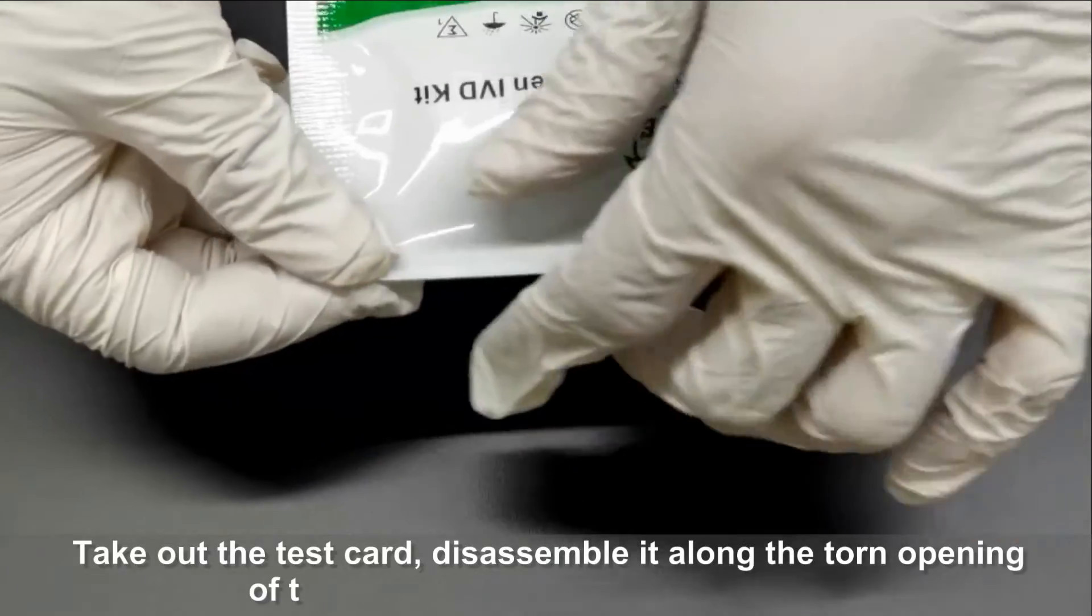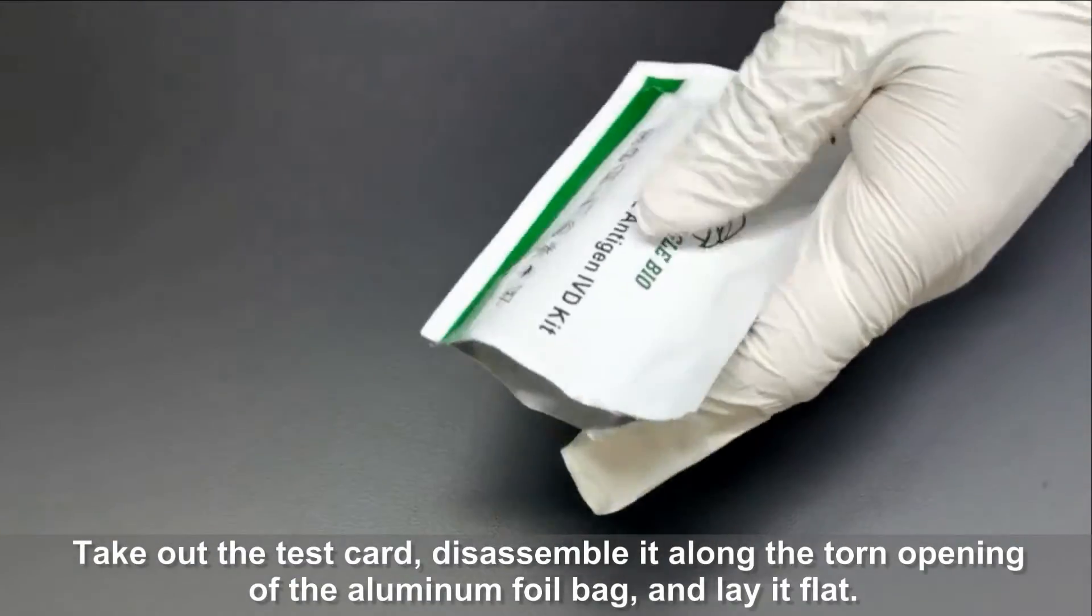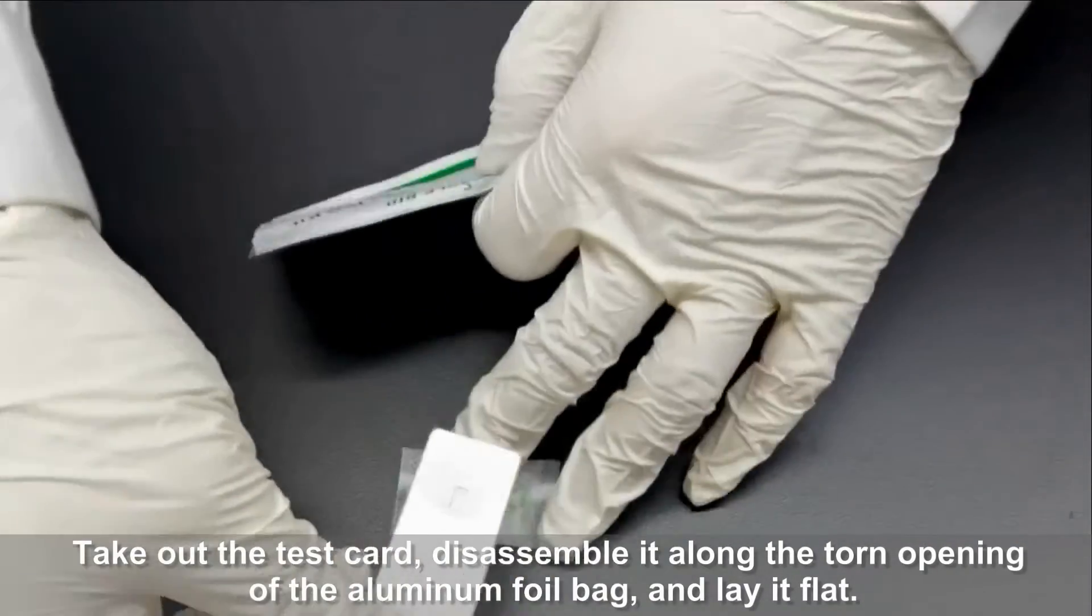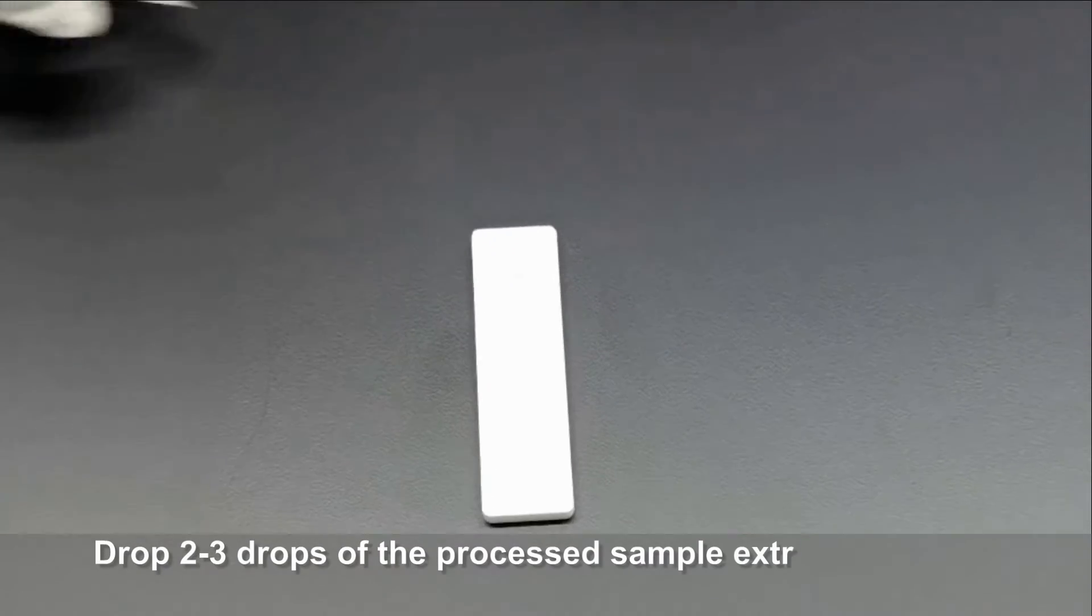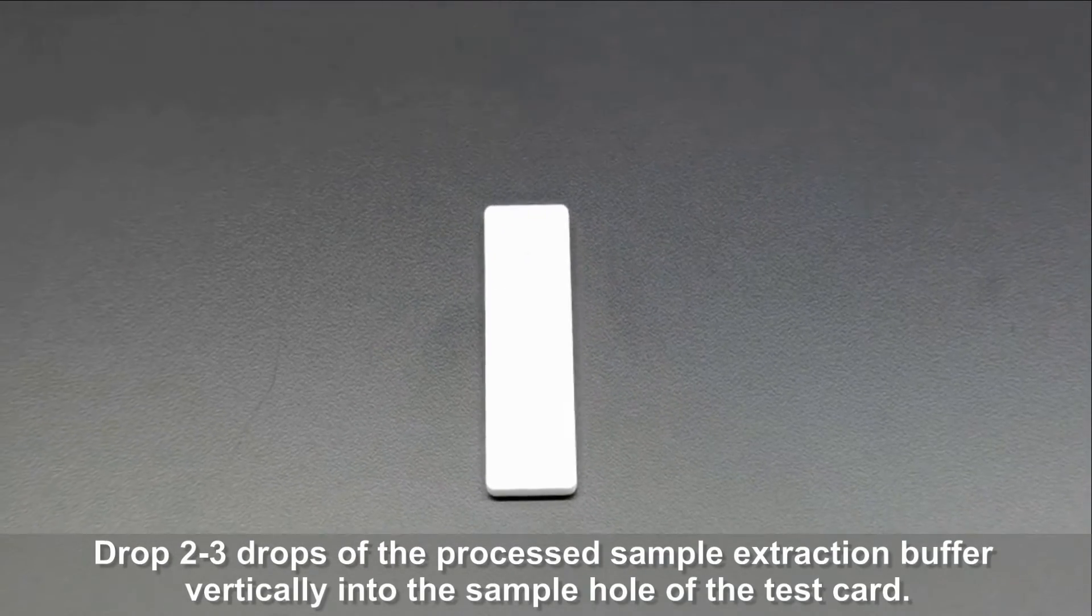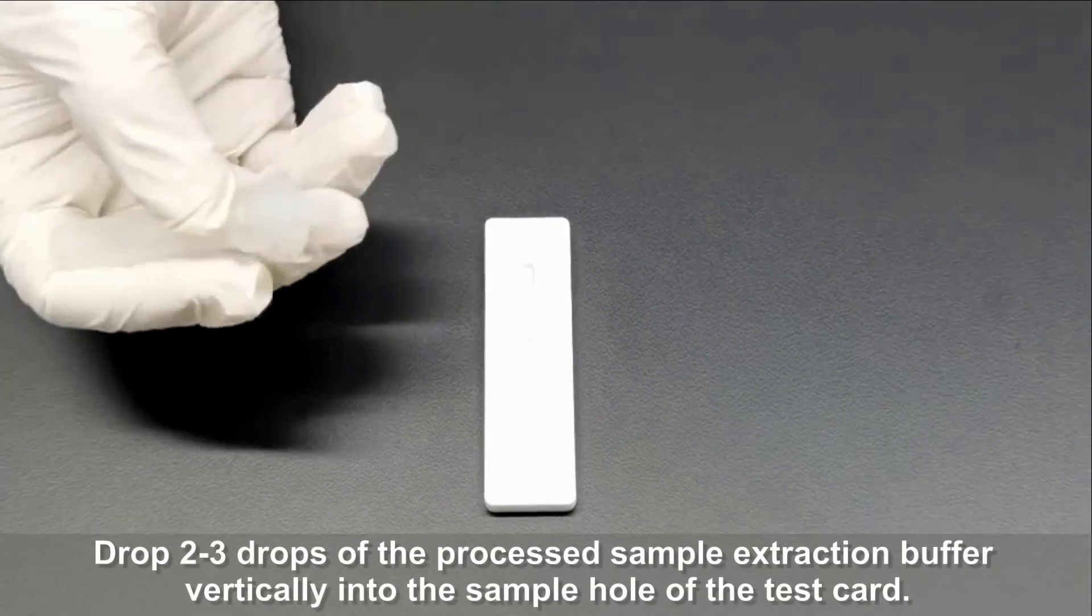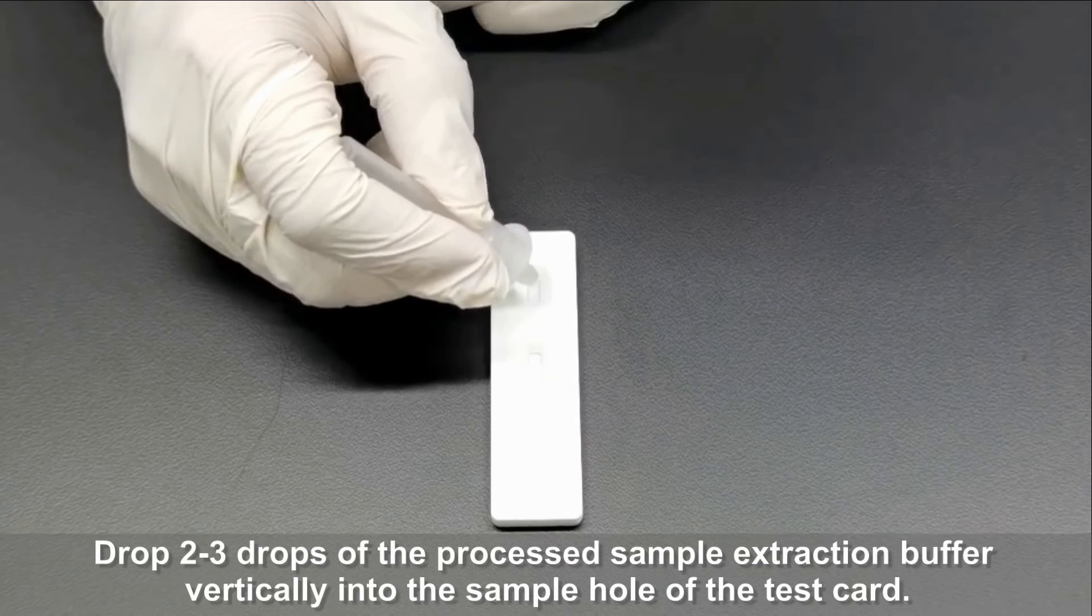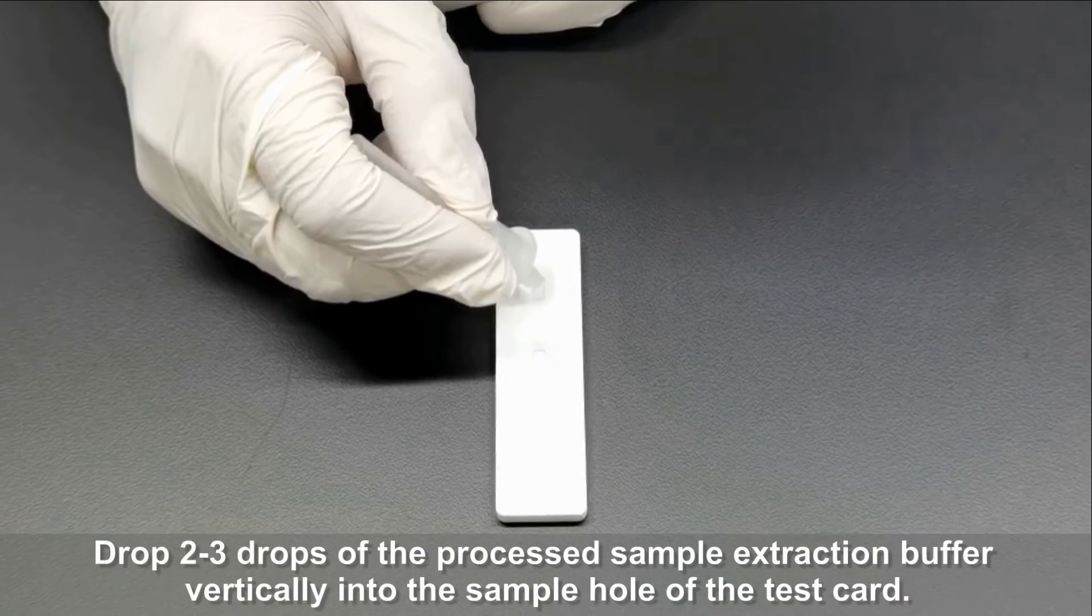Take out the test card. Disassemble it along the torn opening of the aluminum foil bag and lay it flat. Drop 2 to 3 drops of the processed sample extraction buffer vertically into the sample hole of the test card.